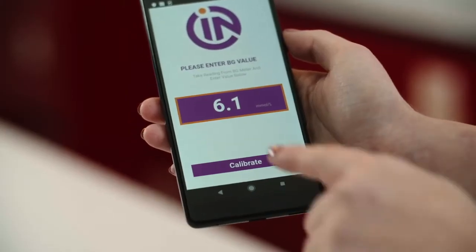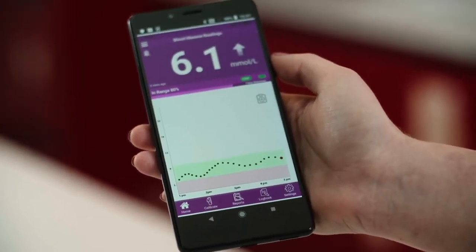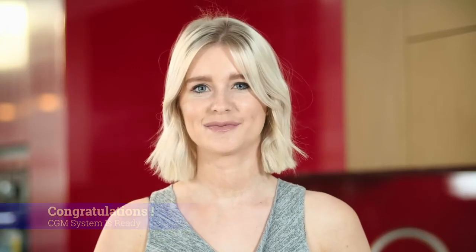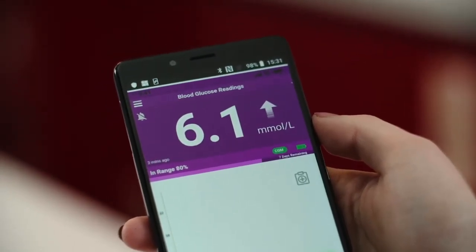Once warmed up, you'll need to add a calibration. You'll be notified when it's time to add a calibration and the calibration screen will pop up. Congratulations — you're now fully set up to start receiving your glucose readings. The GluNovo app will receive a reading every 3 minutes. The home screen of the app shows your last BG reading at the top, indicating how your current BG compares to the last hour of readings.